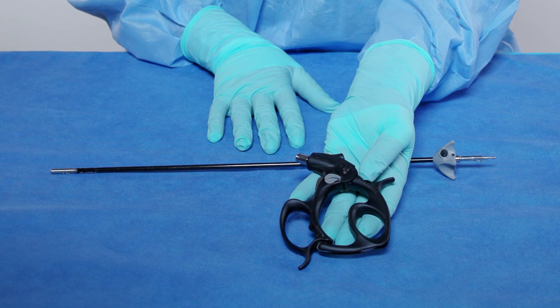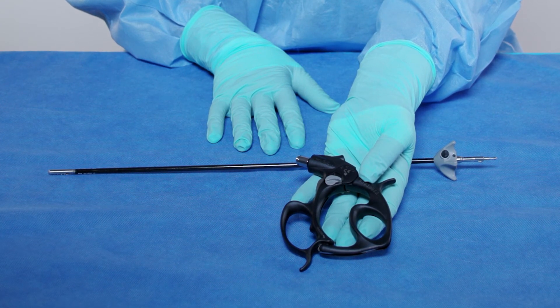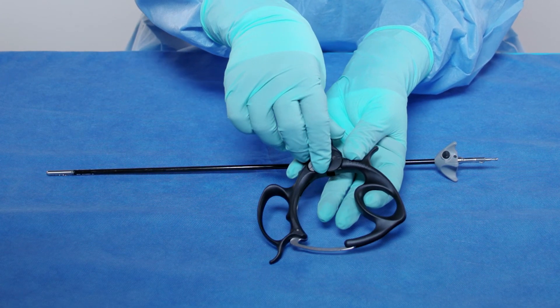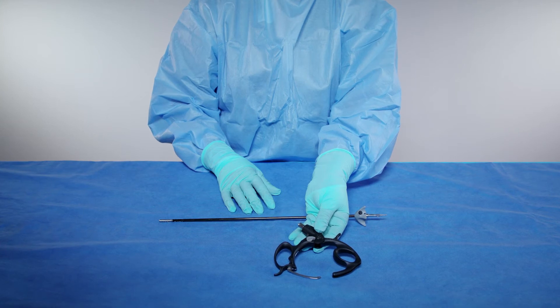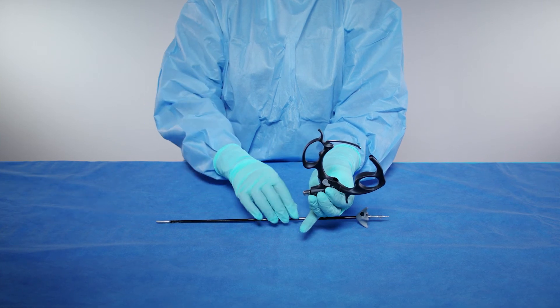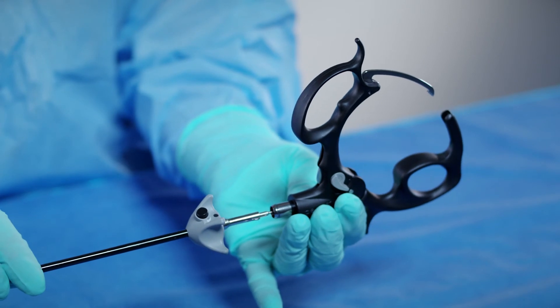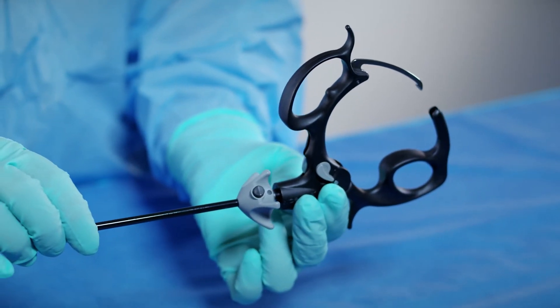If a ratcheted handle, disengage the ratchet by gently pushing the locking lever up and then open the handle completely. Grasp the handle with your thumb and index finger and turn the handle up. Ensuring your hands are not restricting the handle from opening fully, insert the sheath tube into the open handle.